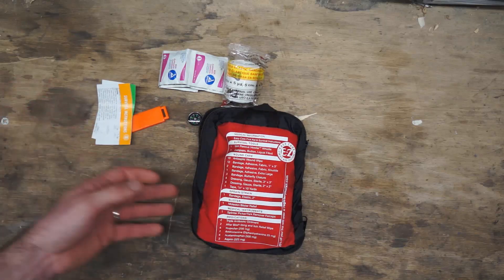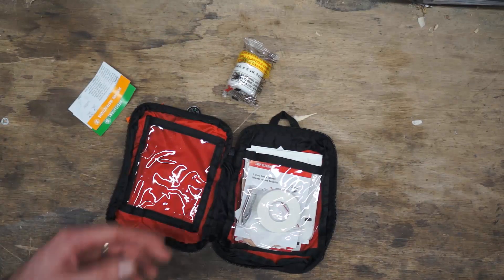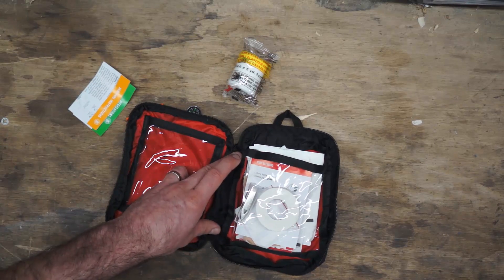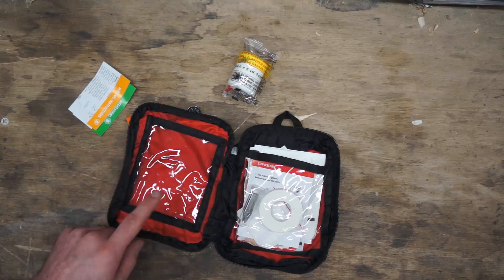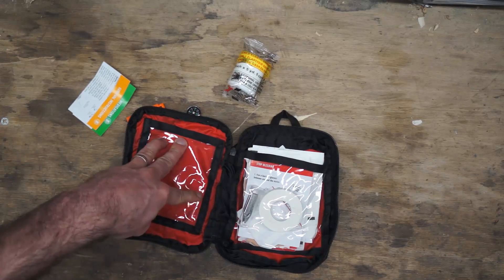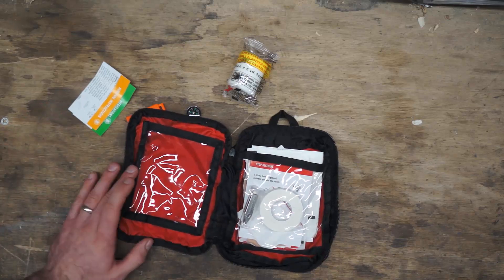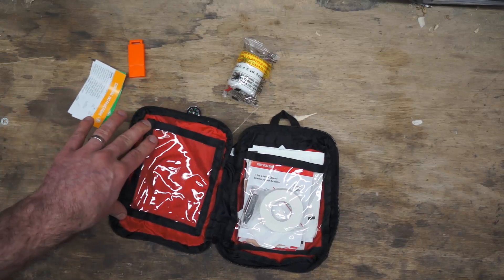You could go the option of adding to this kit — there is some room left over. You could fit something like a SWAT-T tourniquet; you wouldn't be able to fit a CAT or SOF-T as those are too bulky, but I believe you could close it with a SWAT-T. It's better than nothing, so it's something to consider as a great upgrade. The same would apply if you wanted to add a packet of QuikClot or something like that.